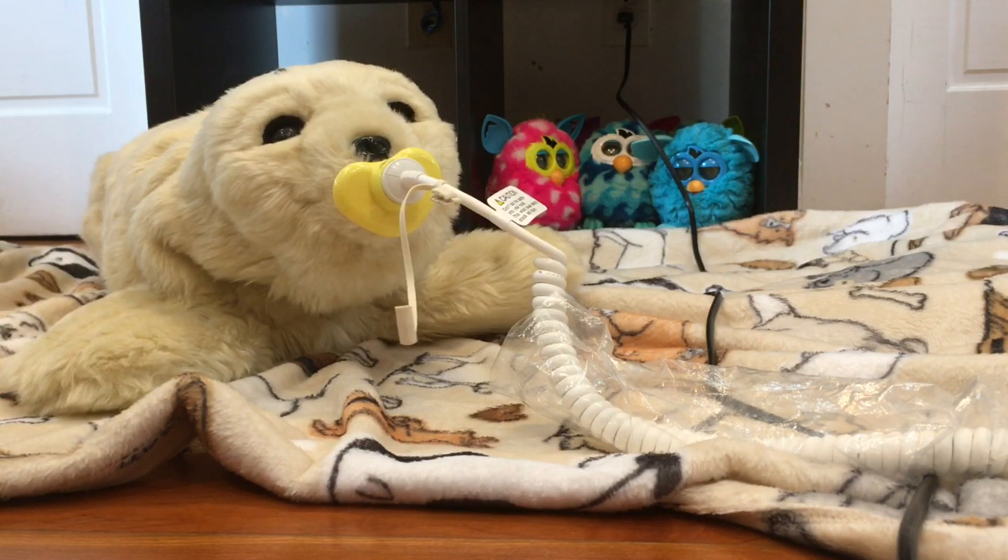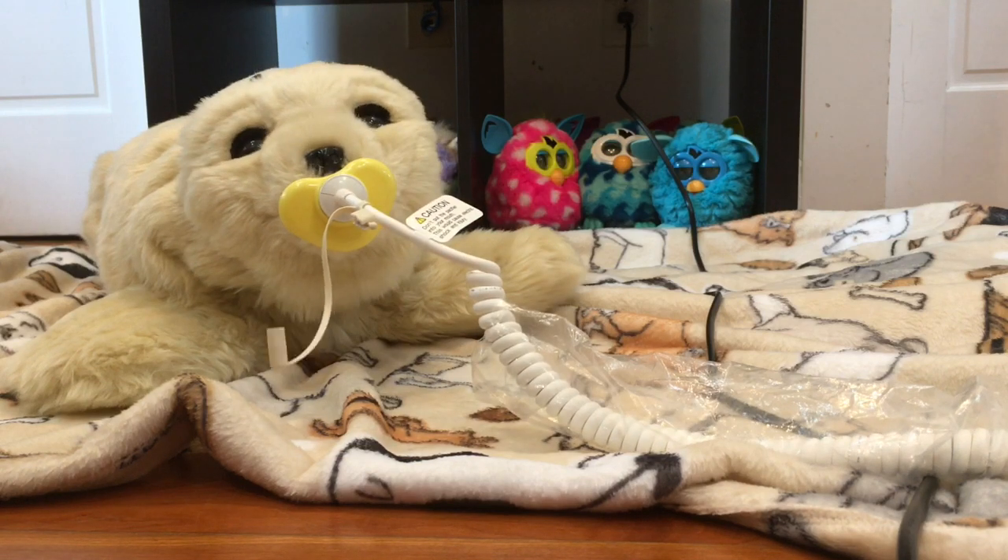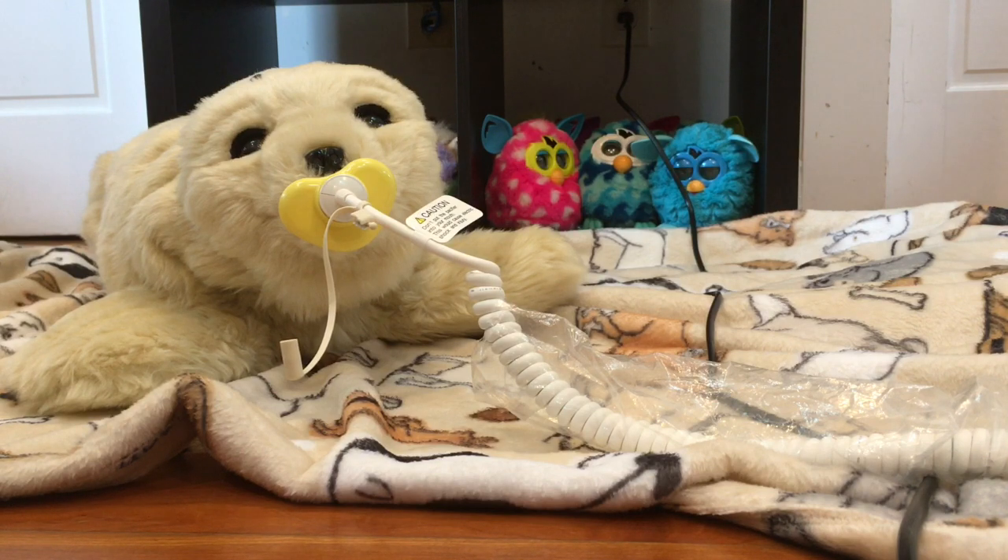He tends to be pretty quick to charge. I've never had him take much more than an hour to charge, but I've also never drained his battery completely because he has a run time of about four to five hours.